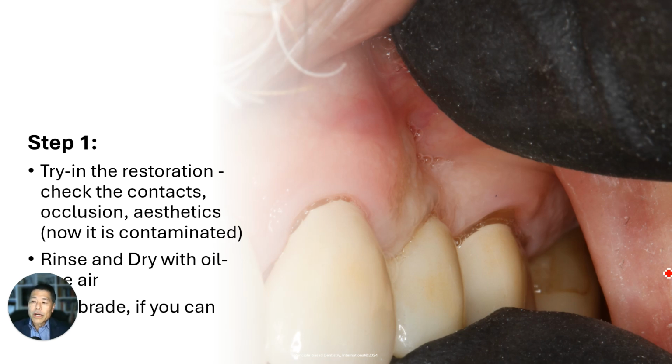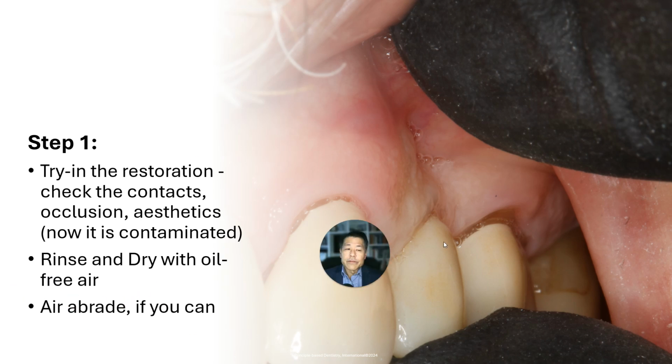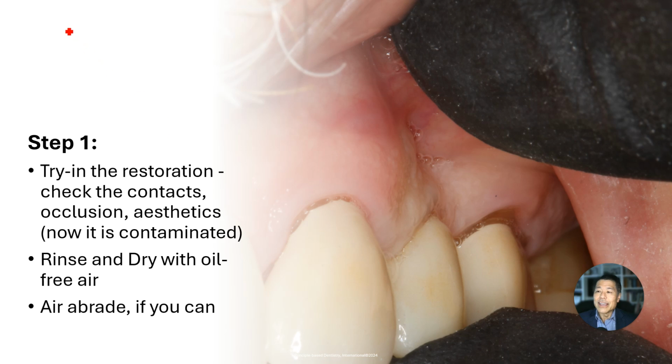So step one in the cementation, I'm going to move my head over to the other side, is to try the restorations in. So I popped the temporaries off, I tried the restoration in, and everything fit perfect. The lab had the mesial and distal contacts on the abutments adjusted right. The occlusion looked good and the color looked good. It was very acceptable to the patient.